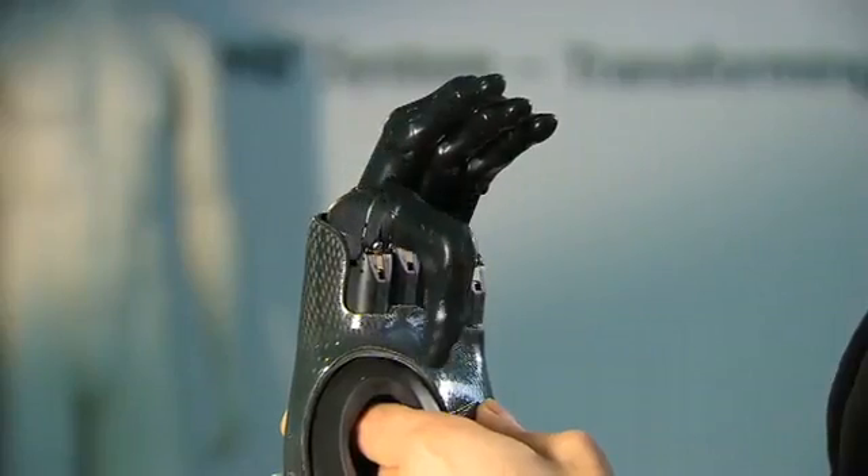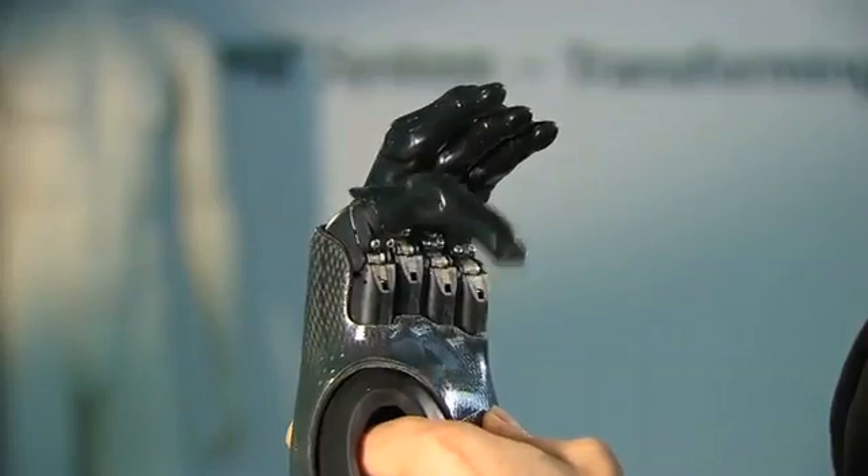This is a first. This is a development of the work that went on with our full hand prosthesis, the ILIM hand. But this effectively is really the world's first development of articulating fingers for partial hand amputees.